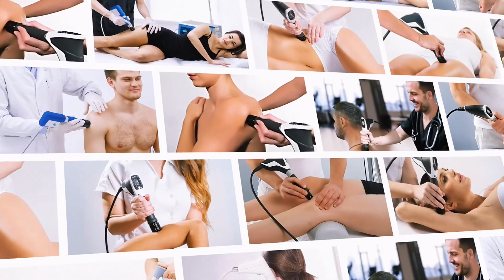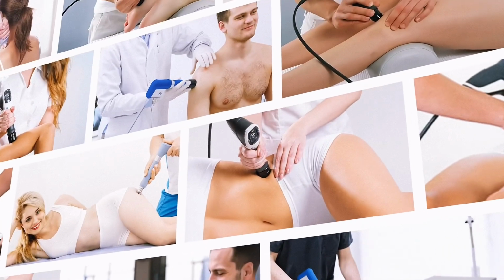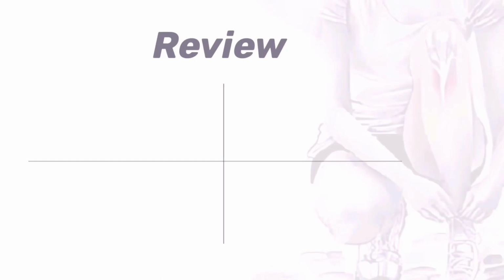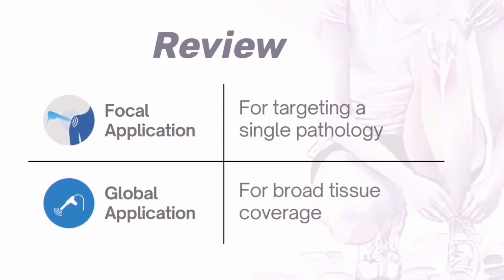Demonstrated mastery of these shockwave application techniques is a prerequisite to the safety and efficacy of medical shockwave treatment. Let's recap. Focal technique for pinpoint pathology. Global technique for tissue coverage.